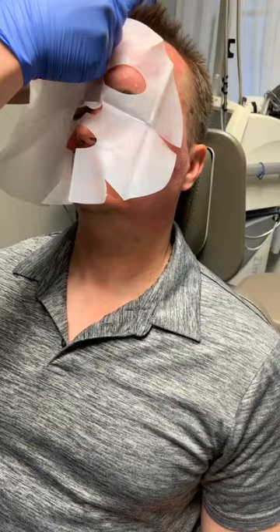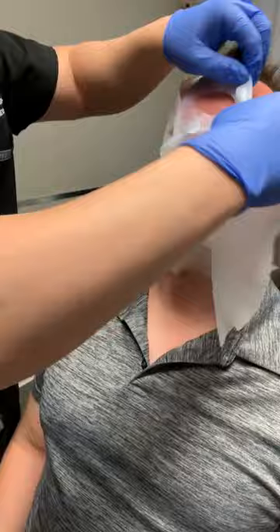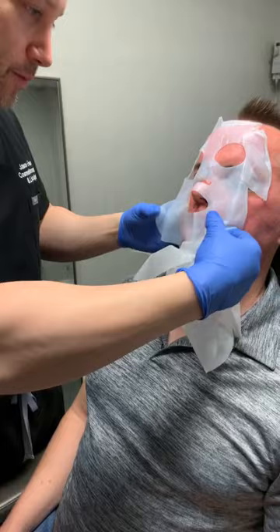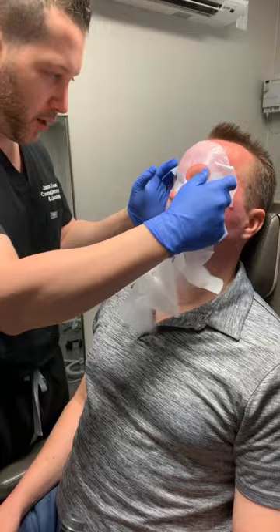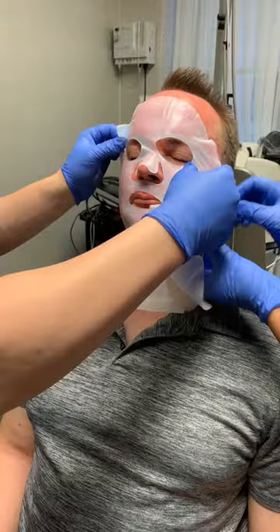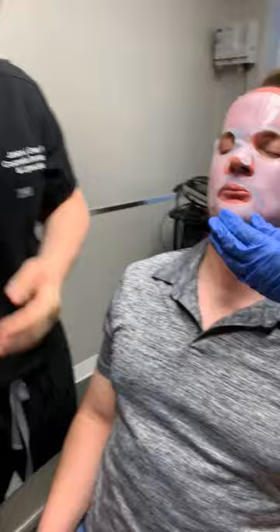How's it feel? Good. Yeah, it helps right after the laser. Most of these are made of a biocellulose — a polymer that's embedded with rich ingredients to help his skin heal. That's what he needs right now. Hopefully he won't go into something like this scaring people in New York — not a Halloween look! But regardless, it looks so good and works so well, we have to do it. So that's our healing protocol after laser, desiccation, and some Botox.